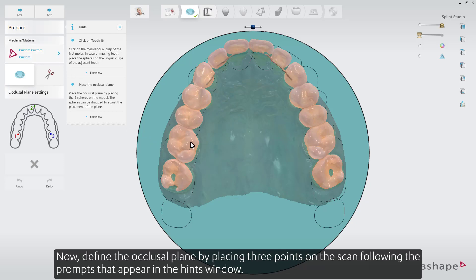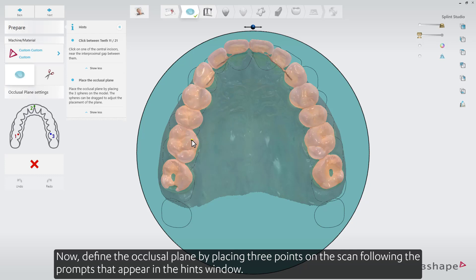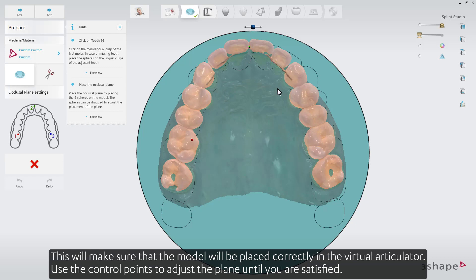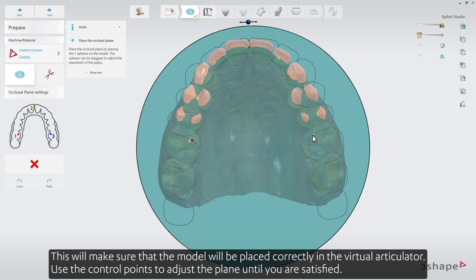Now, define the occlusal plane by placing three points on the scan, following the prompts that appear in the hints window. This will make sure that the model will be placed correctly in the virtual articulator. Use the control points to adjust the plane until you are satisfied.